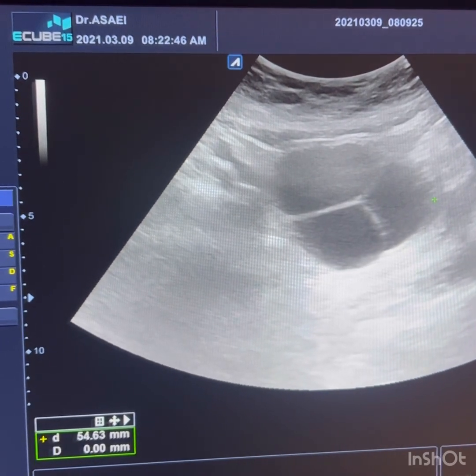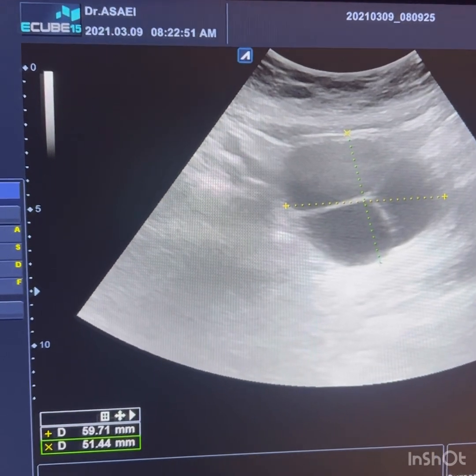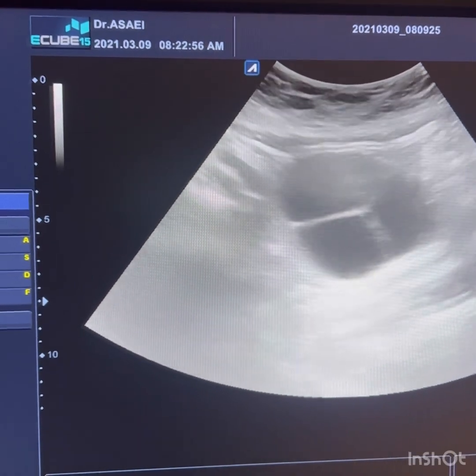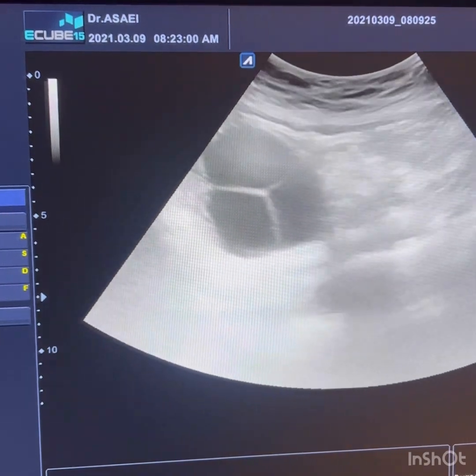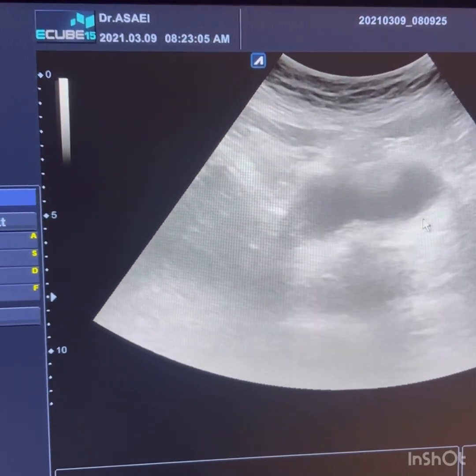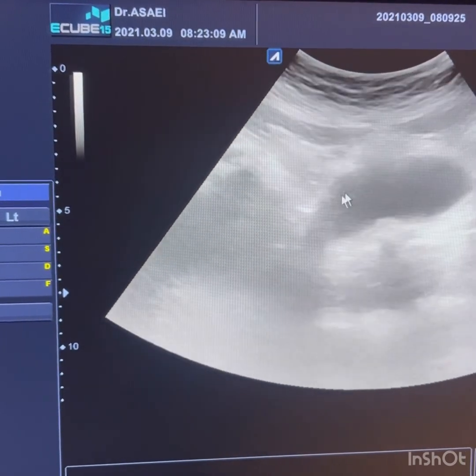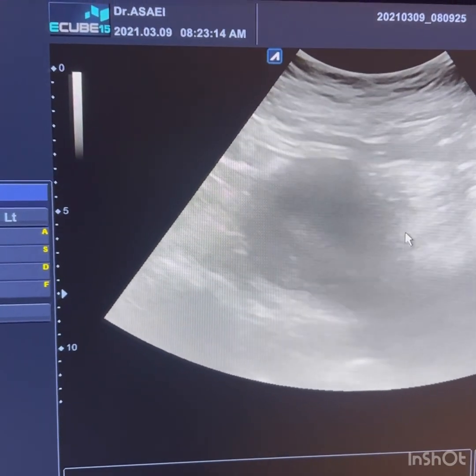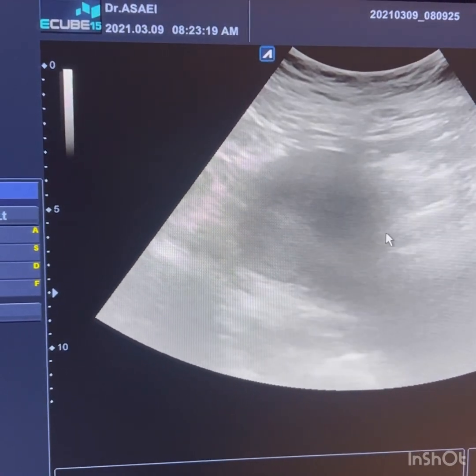There are 2 criteria which make a septated cyst suspicious, needing further workup. There are thick septa and mural nodules, which we will discuss later on. In this patient, we can see the urinary bladder and also the uterus with endometrial cavity.